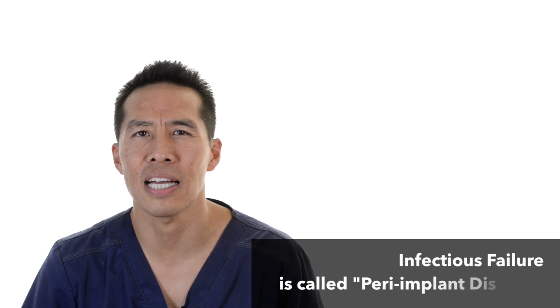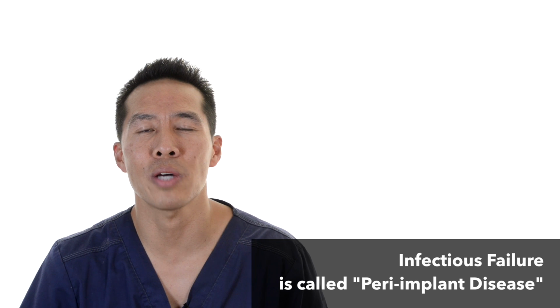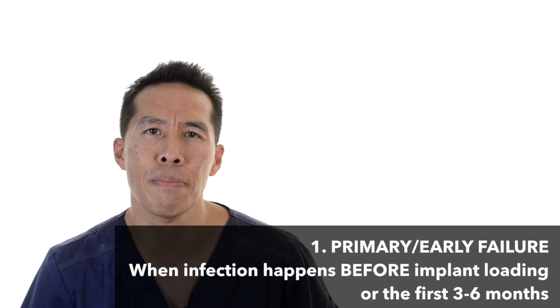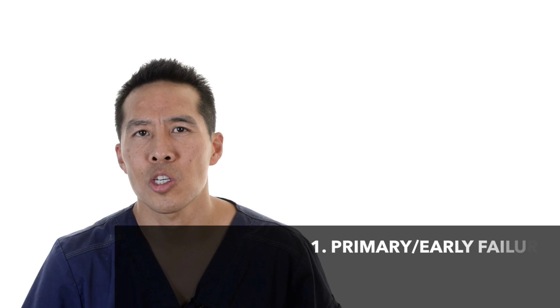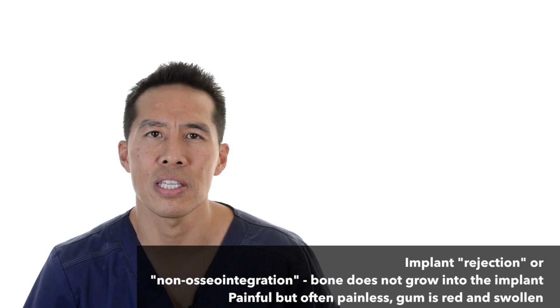Infectious problems with implants is what we call peri-implant disease, and this is very similar, I suppose, to periodontal disease when we look around natural teeth. There are two types of peri-implant disease. One is what we call primary problems, which usually happens before the implant is actually loaded, within the first 3 to 6 months. This is sometimes called rejection, or this is when the bone doesn't grow into the implant.